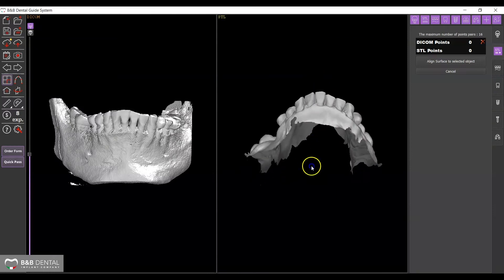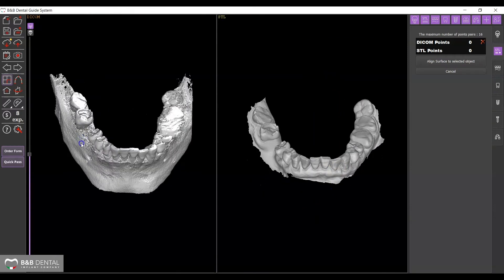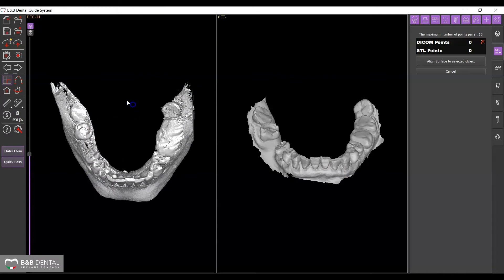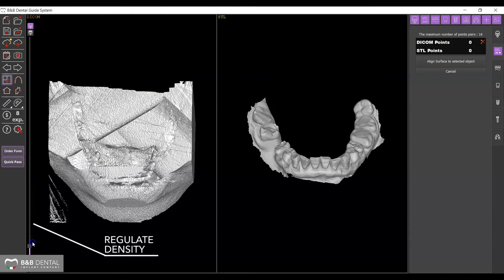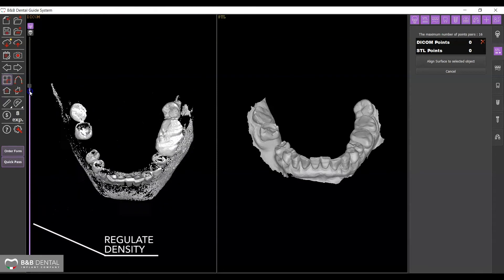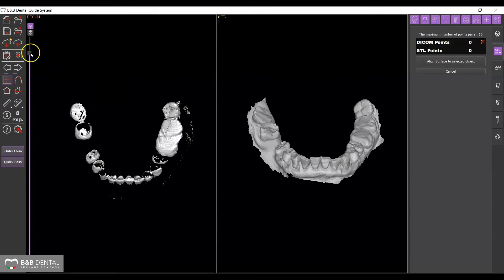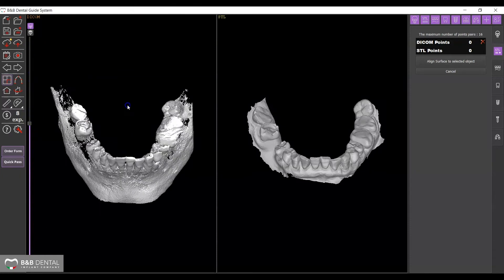The screen will be divided in two, with the previously imported DICOM file on one side and the STL model on the other. Use the levels next to the DICOM display to adjust the density, providing better recognition of the details useful for matching.